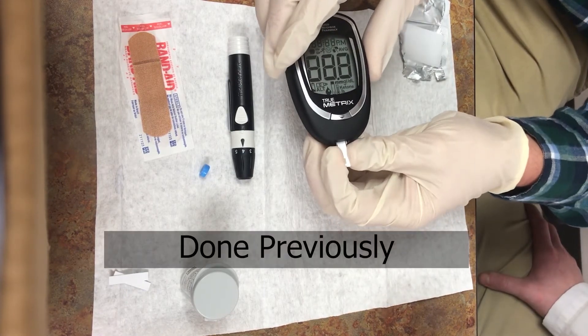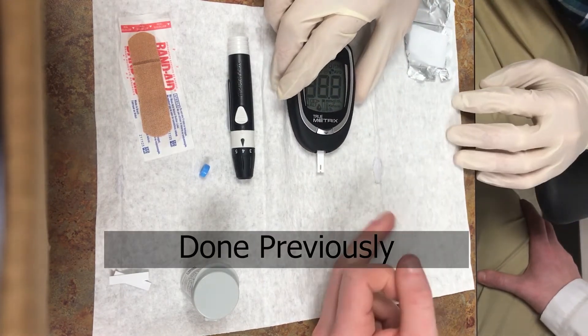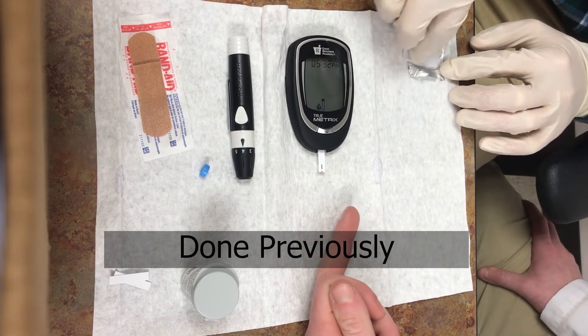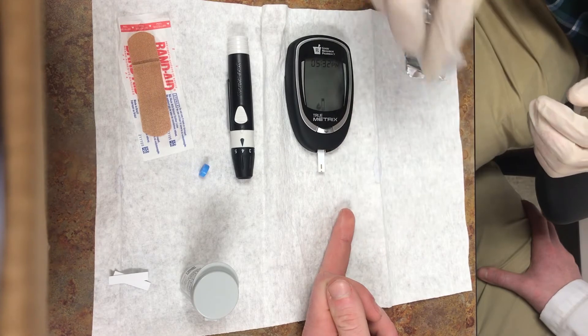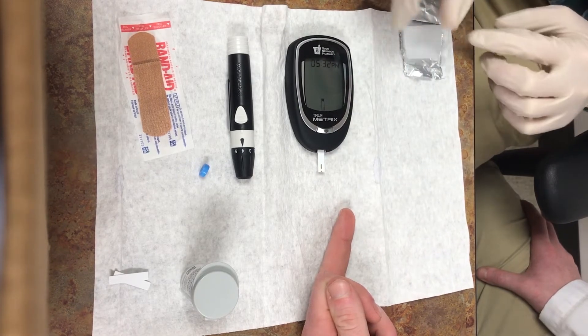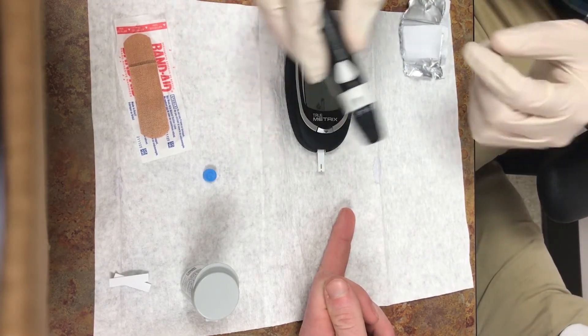Insert a lancet into your lancing device and prime the lancet using the priming button. Using an alcohol swab, clean the finger that you will be pricking.